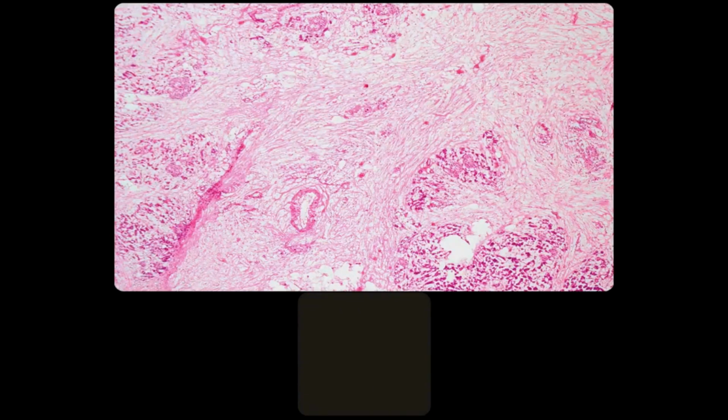Okay, another example, lots of atrophy, and you've got single glands here, and you've got islets there and islets there, and you see how the islets have survived in contrast to the acinar tissue. Still looking reasonably pristine and intact. And you then say, oh, this is a large duct, but look at the relationship with normal structures. So it's equidistant, it's non-infiltrative, and therefore you start to examine that carefully and then look for more evidence. So don't only base it on one feature.